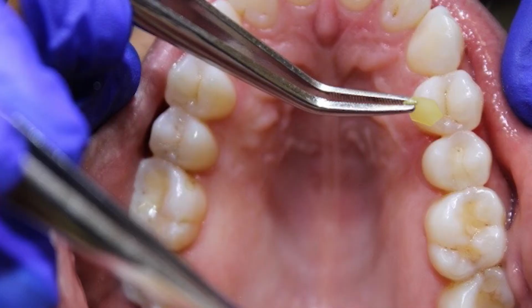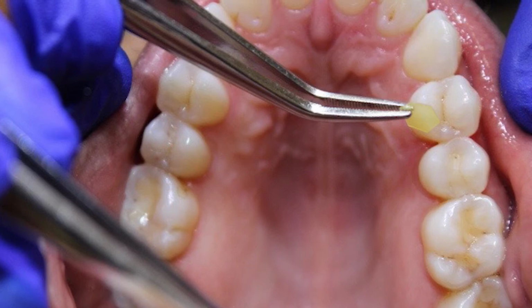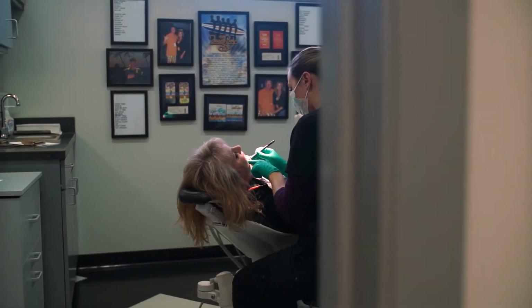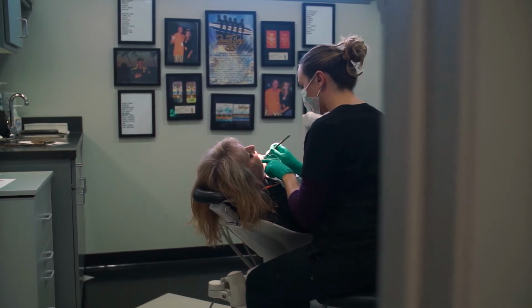our patients. The disc simply slides in between the teeth and no discomfort to the patient whatsoever. They hardly even notice it's there. I just have to mention to them, don't eat or drink for the next 30 minutes, don't floss that area, and go on with your day.